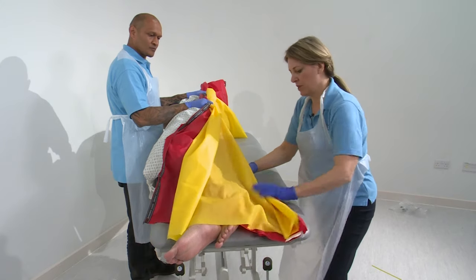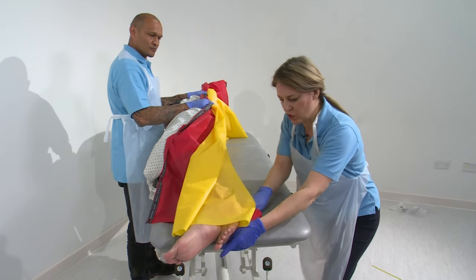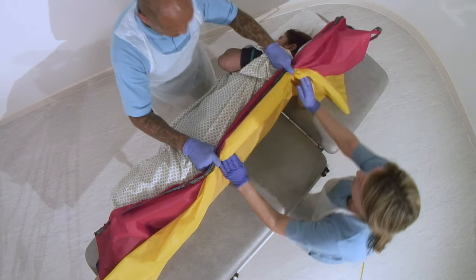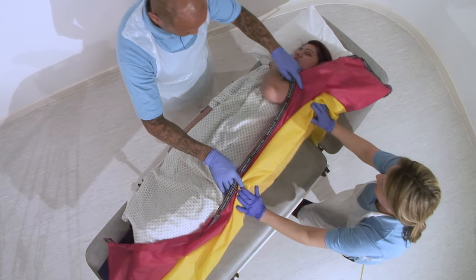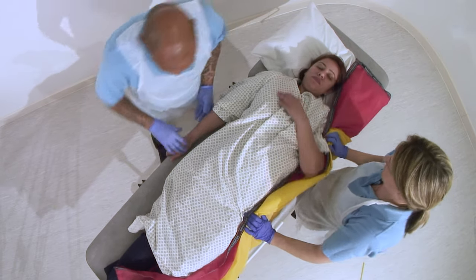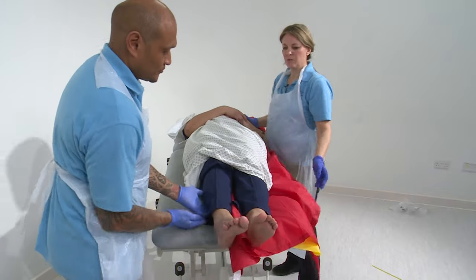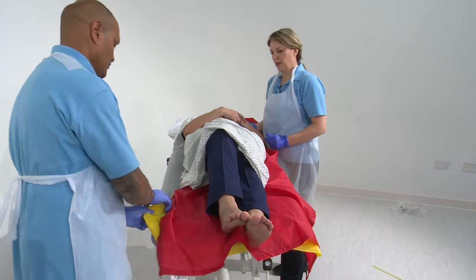Now what I need to do is just roll it up towards my patient, find her feet, push down into the mattress. Now I'll come up and take my patient at the hip and shoulder and Rob, if you can just gently let her go back towards me. Thank you. Rob's just going to take that slide sheet out from underneath the back of the legs and unfold it down.